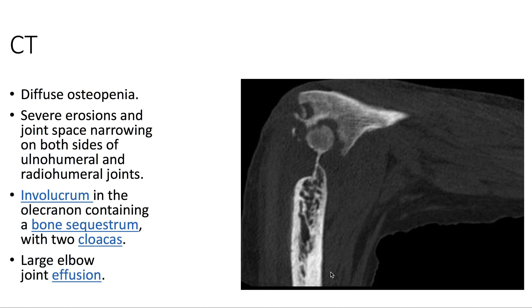On CT of the right elbow, we can appreciate diffuse osteopenia, severe erosions, and joint space narrowing. Again, we see a bone sequestrum with the surrounding involucrum, with two cloacas — one appreciated here.